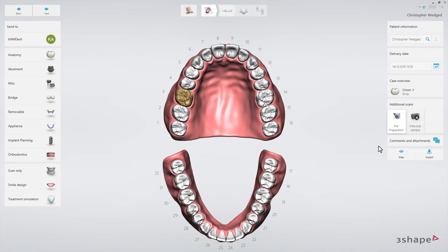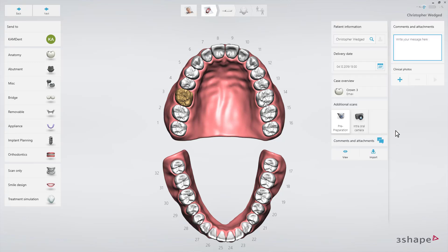You can add comments to the order. Select Comments and Attachments, then press the blue plus icon to add patient images or attachments.